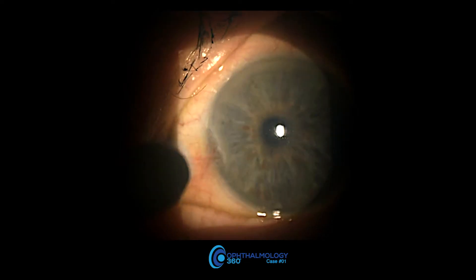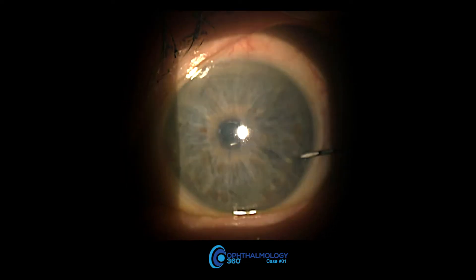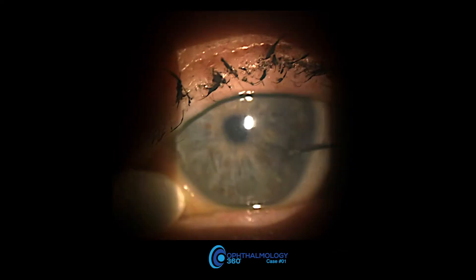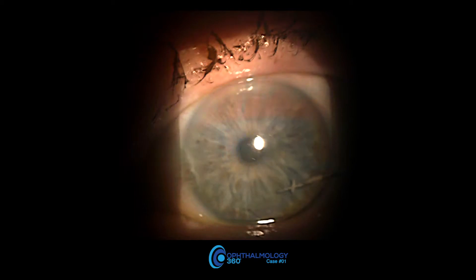Here's a patient where I was planning on doing counterpressure with a Q-tip, but it just wasn't working out with the patient. So I pretty much did it without counterpressure. You can see it's a little bit harder to get in without the counterpressure.